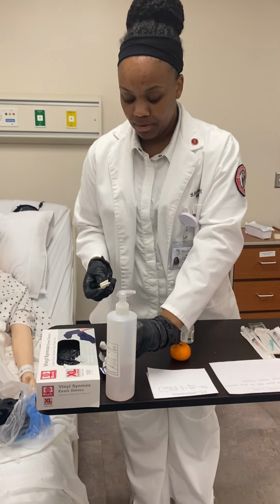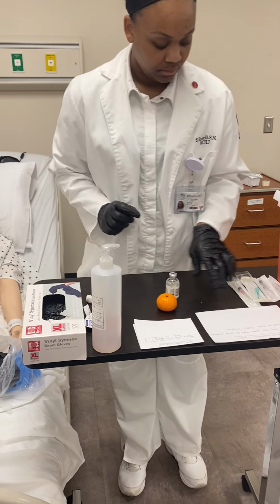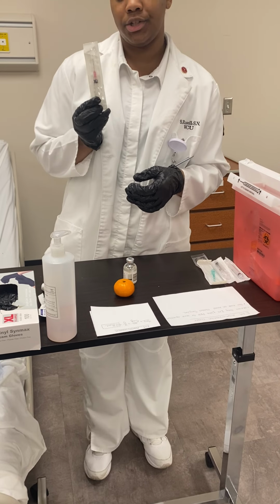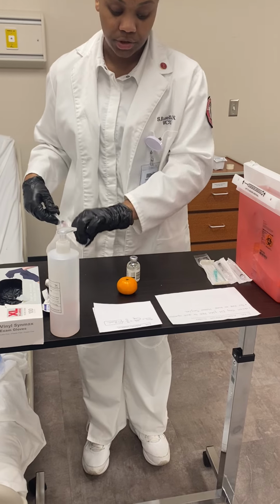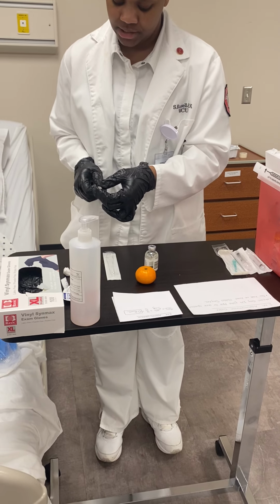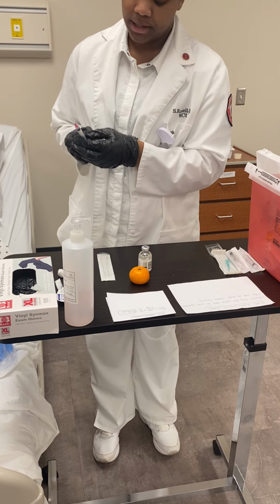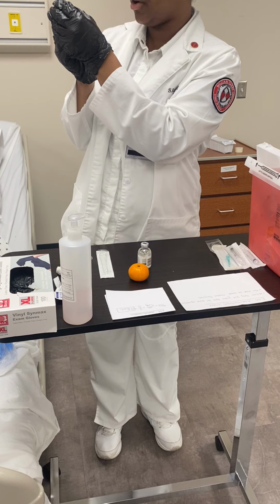I'll grab an alcohol prep pad, cleanse the top of the vial. Have my needle here. Today we're going to be using a 22 gauge, 1.5 inch needle to be drawing up and administering the medication today. So we're giving 0.8 mils. So I'm going to pull back 0.8 mils of air first.